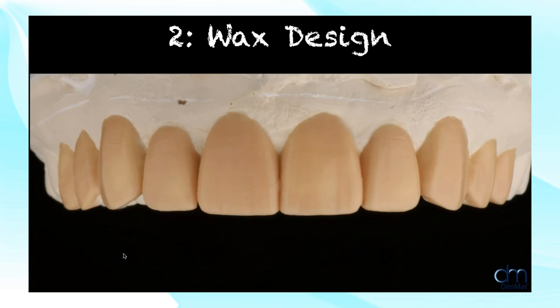So why is this so important? It's important because this is going to be the smile that your patient is going to see. When the lab sends you this wax design, they're not just going to send you a wax design.